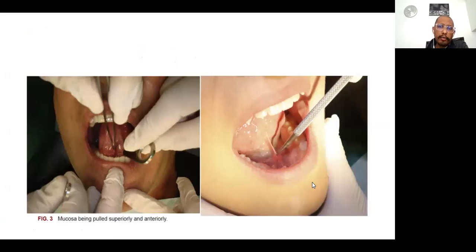So these are pictures from an outpatient procedure, and you can see the position of the tongue, and that's the position you want to obtain when you do it intraoperatively as well. We have these atraumatic forceps that we use, and you can clench the area to try and straighten out the duct. You use your conical dilators on the right, and you can see the lacrimal probes that we use at Somerset as well.